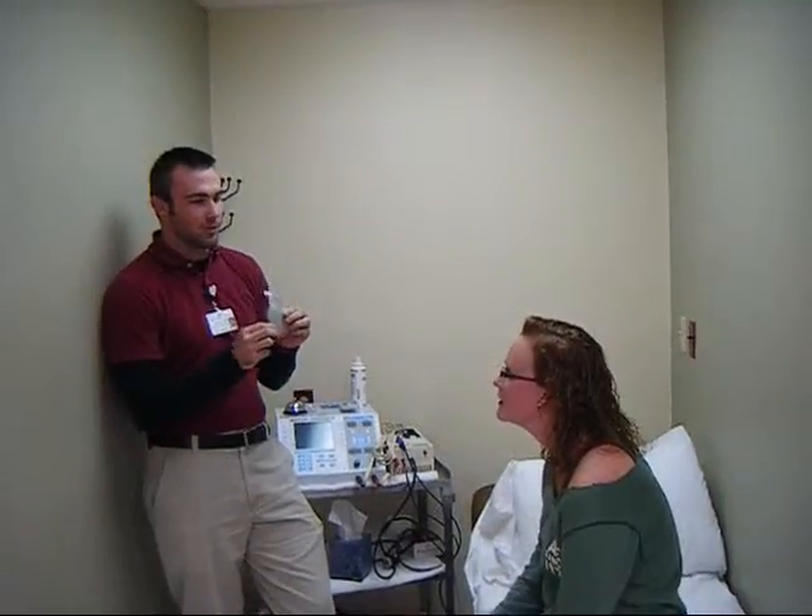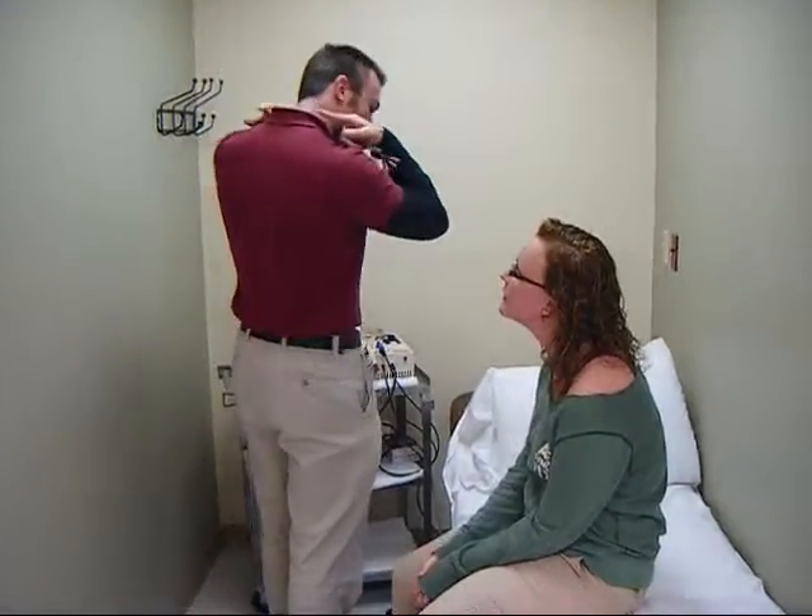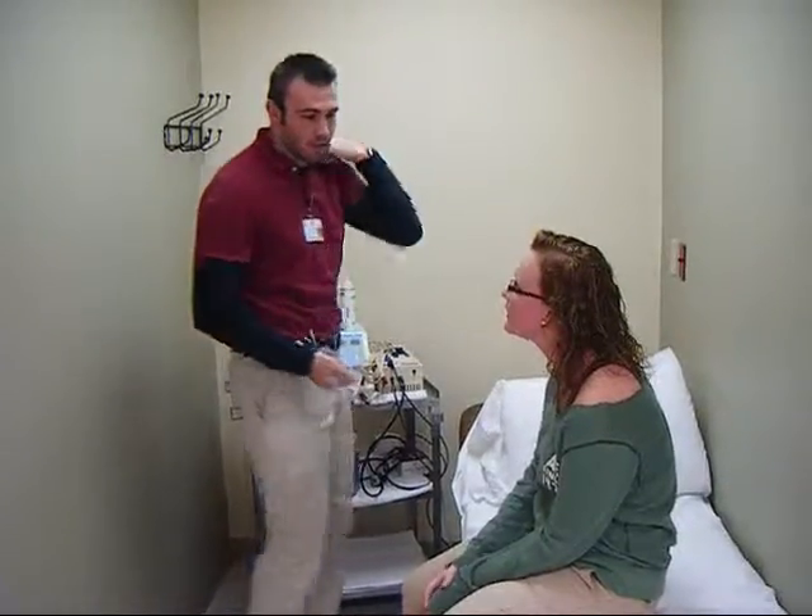So, have you had electrical stimulation before? No? Alright, so basically what's going to happen is we're going to put these electrode pads right on your neck — right where it hurts. So we're going to put one here, and here, and one here, and on the other side.